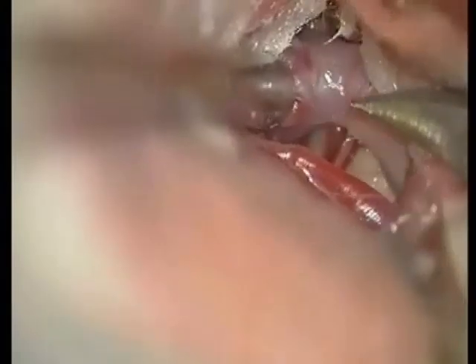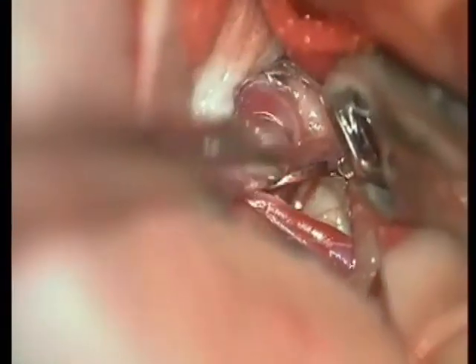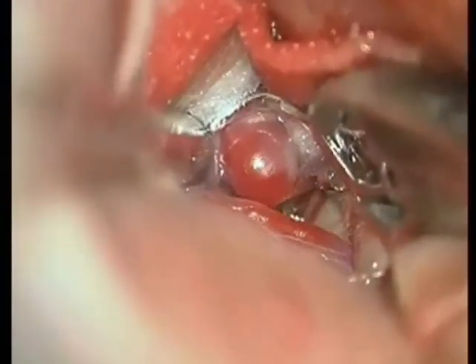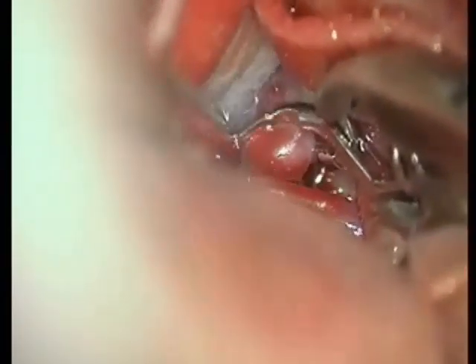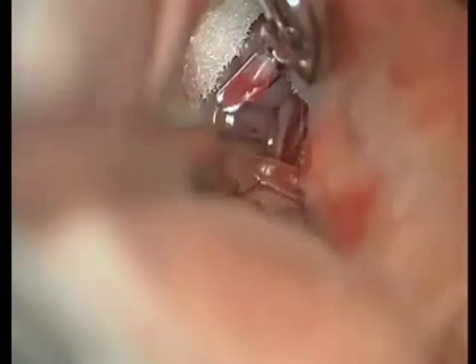As we have good control over the aneurysm, we place a curved pilot clip directly over the aneurysm without a temporary clip. Small aneurysm remnant remains outside the clip plates, as can be seen. The aneurysm inside the clip can be safely reshaped with bipolar coagulation.